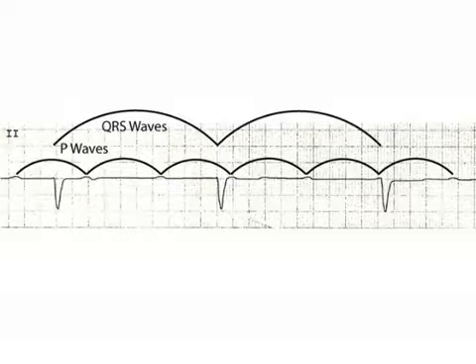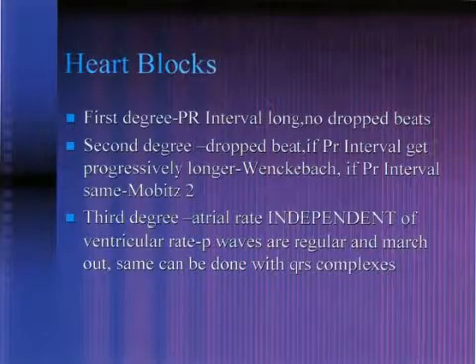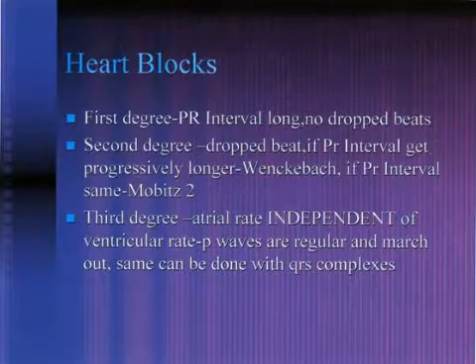Yeah, that's a very good tracing, Melissa, and this oftentimes requires a pacemaker. And I always like to remind myself that heart blocks are often like burns, and that's an easy way to remember it. A first-degree burn is not as serious as a third-degree burn, and with heart blocks, it's the same analogy.